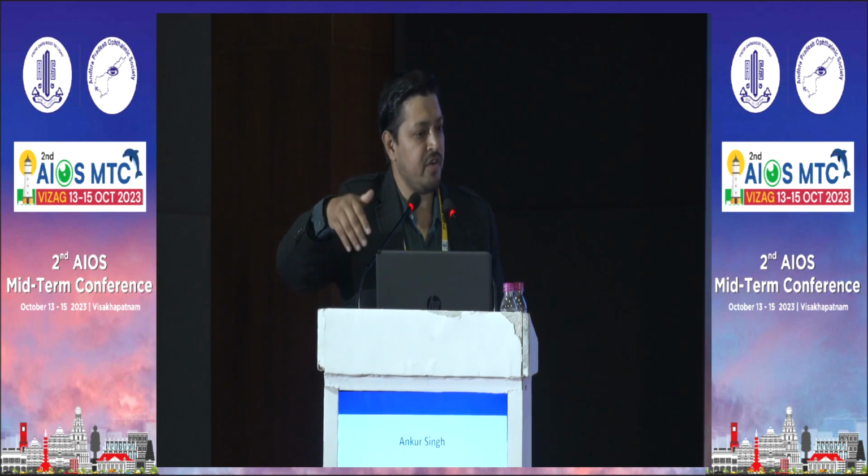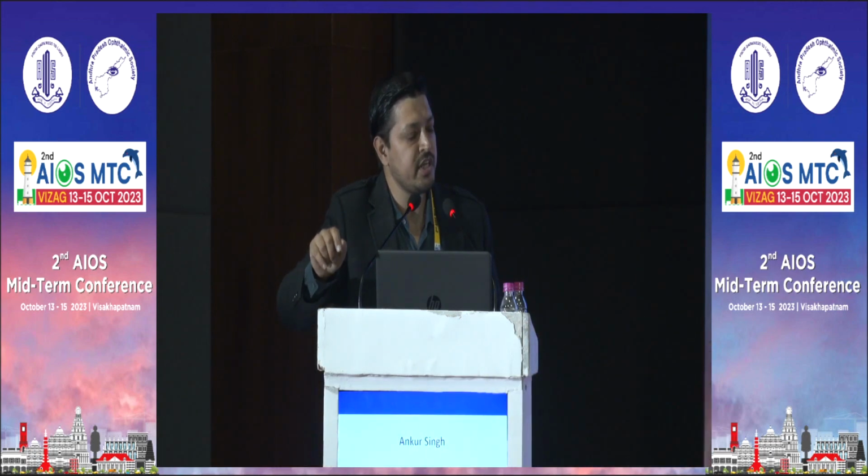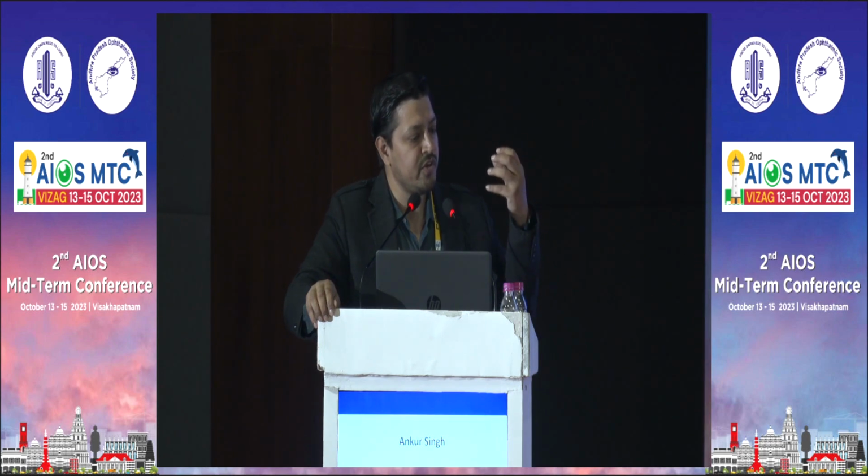So you made a statement that Octa can't replace FA. As of now, it has not. So what is the current role of Octa then? So mostly the posterior pole pathology, especially ARMD, when we are looking at the posterior pole per se. We are looking for any new vascularization.